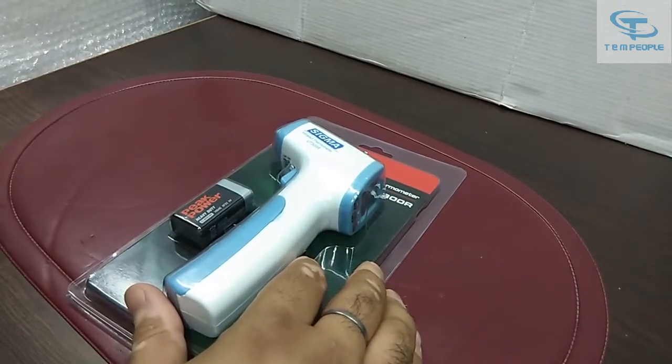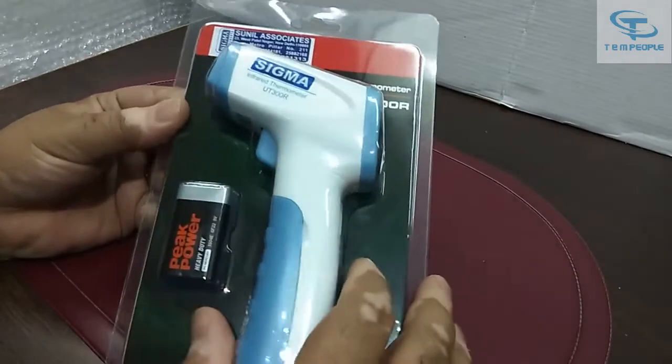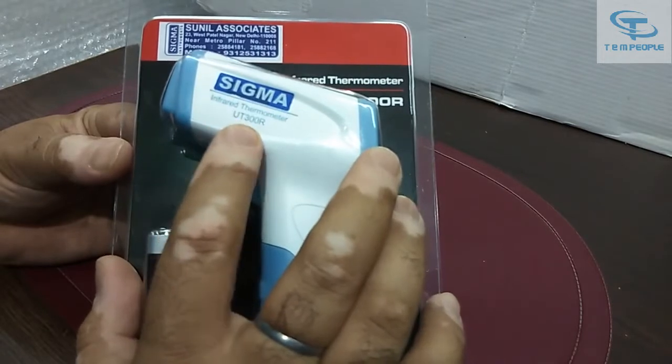My name is Rohit and today I will give you a demonstration of a meter which is an infrared thermometer. The make is Sigma and the model number is UT300R.